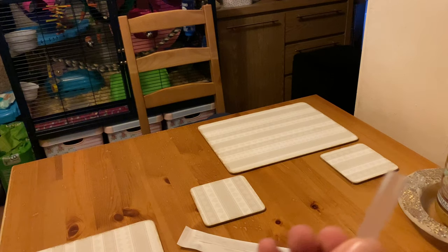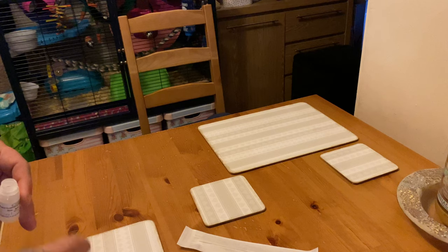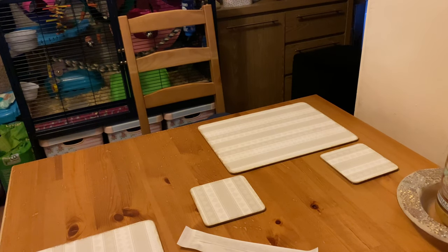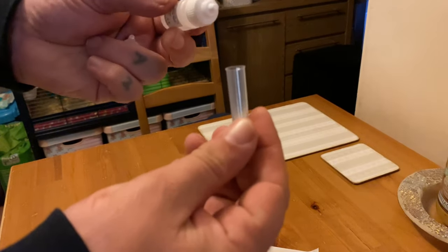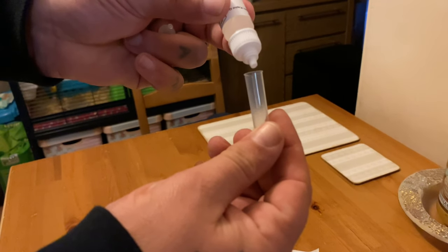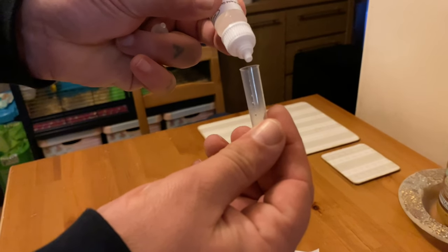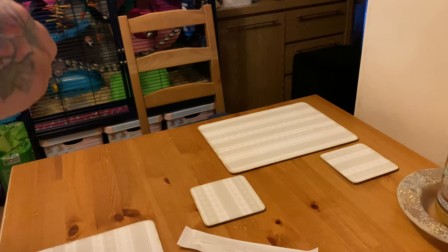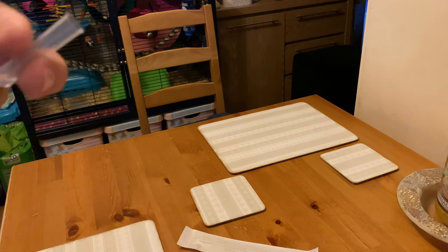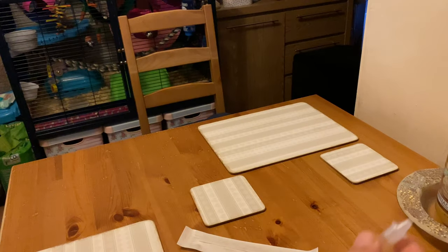The first thing you need to do is get this little plastic thing. You need to put six drops of the fluid into here — so one, two, three, four, five, six.